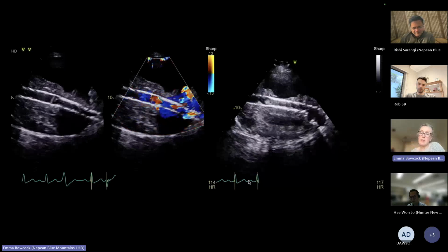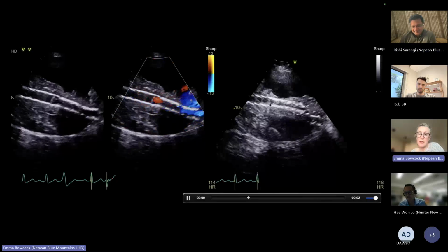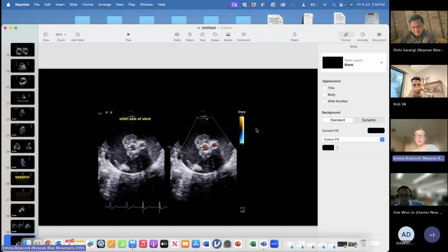And then you can probably see a bit of thrombus in this one. Can you see that? That mobile thing, it's wiggling there. So we did contact, and then you can see that there is essentially this flow in the trouser leg part of the graft. But yeah, highly concerning, and you need to look at previous images. And the vascular surgeons came. We actually didn't do anything about it.